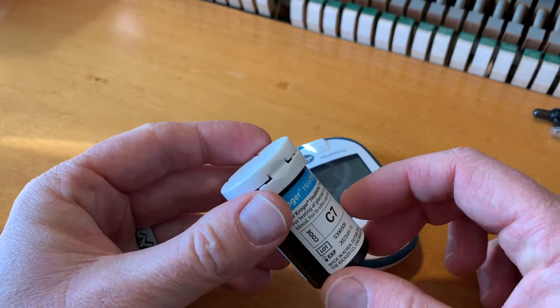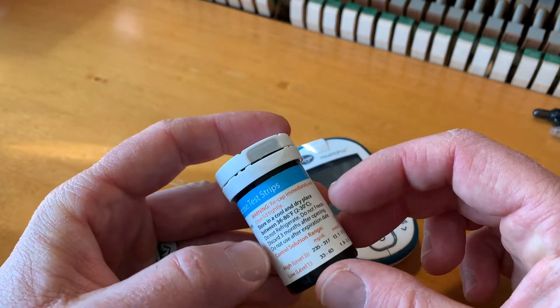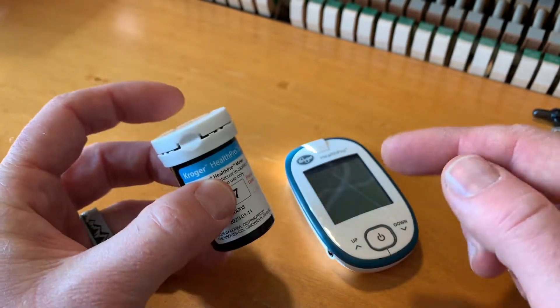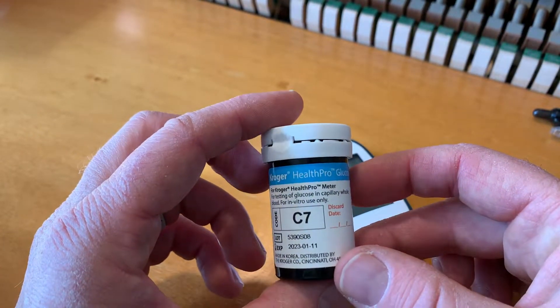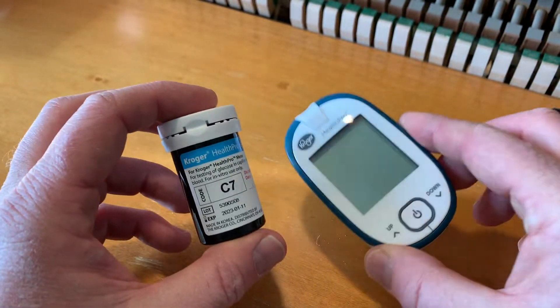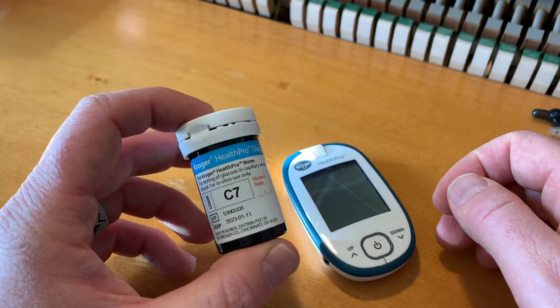Now again friends, this is not an official tutorial. This is simply showing you how I'm doing this for entertainment purposes. So consult your health provider to do this, especially if you have concerns with diabetes and dangerous blood sugar levels, because you do not want to mess this up. This is something that's very important for people that struggle with high blood sugar.